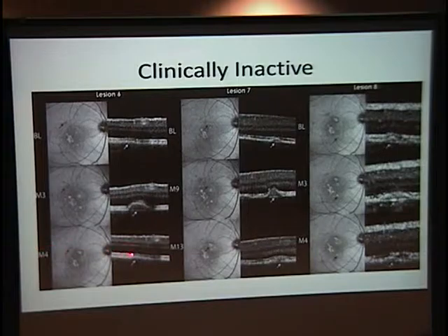The patient comes back a month later, that's flattened back out. And here's your ISOS junction. You have it run here and here, but you lose it during this phase of this material deposit. Comes back a month later. ISOS junction looks good, and things have settled down. And this isn't a patient who really had any symptoms.